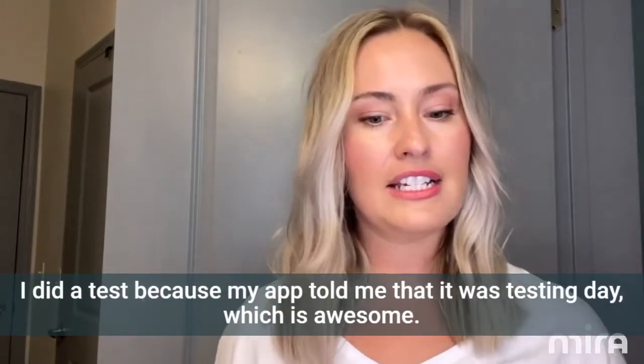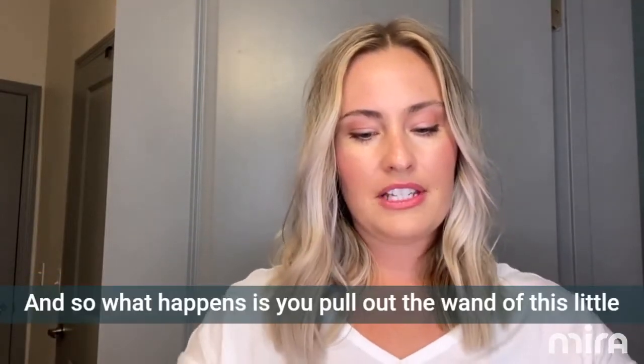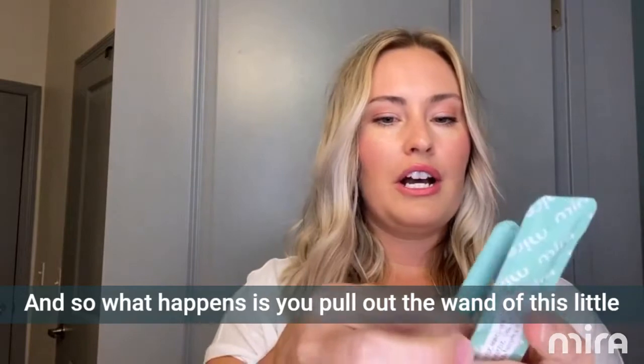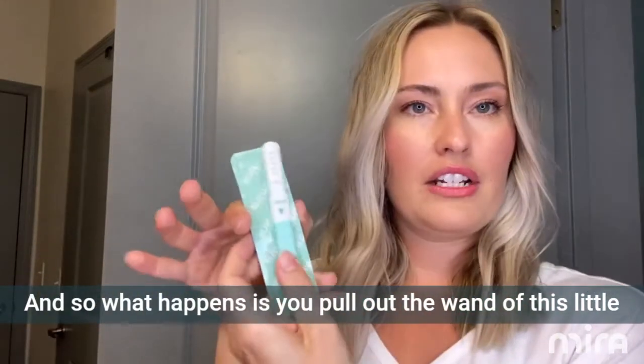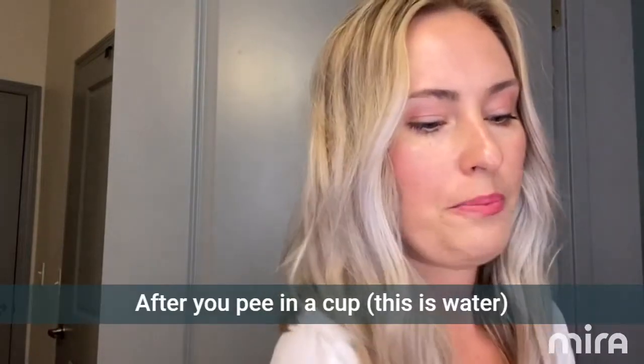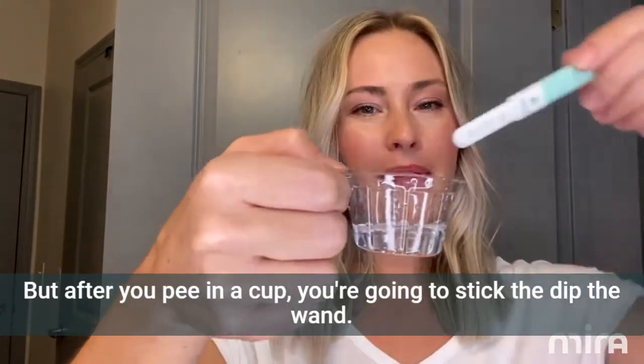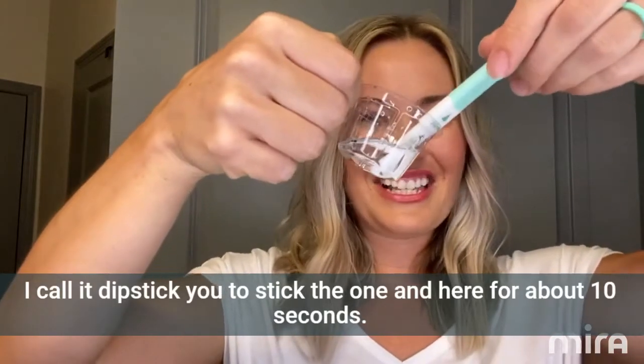This morning I did a test because my app told me it was testing day, which is awesome. What happens is you pull out the wand from this little packet. After you pee in a cup — this is water, but after you pee in a cup — you're going to dip the wand, I call it a dipstick, in here for about 10 seconds.